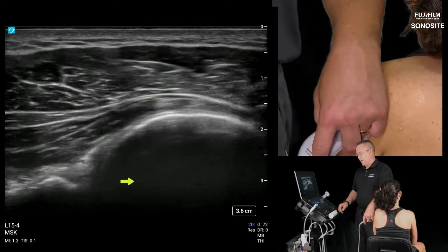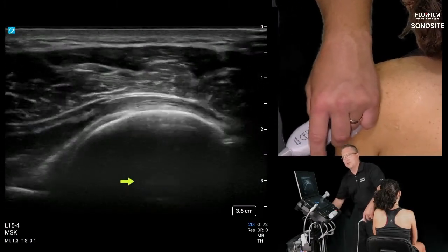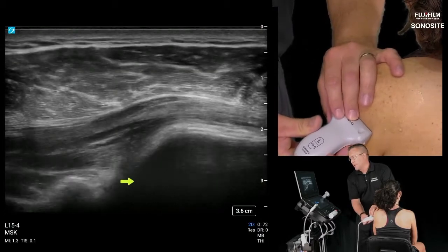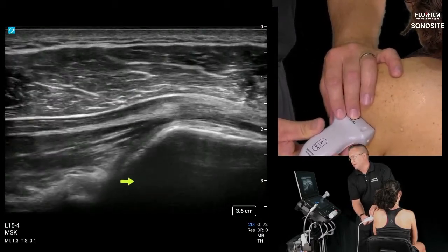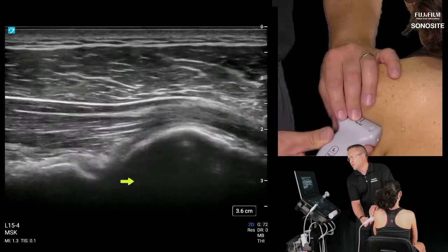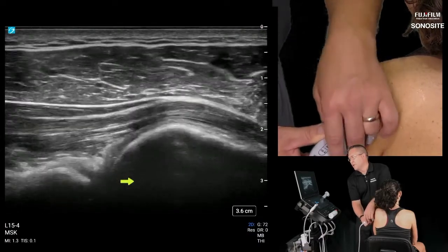So by doing this really sharp angulation upward, here, move my big hand out of the way for the camera, we can see the central tendon really nicely. We can see the posterior glenohumeral joint, and we have a nice skeletal reference point to follow.